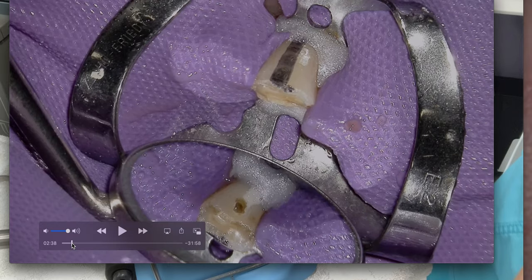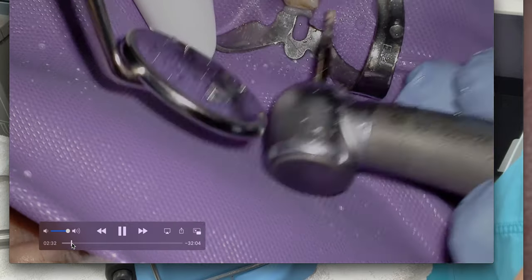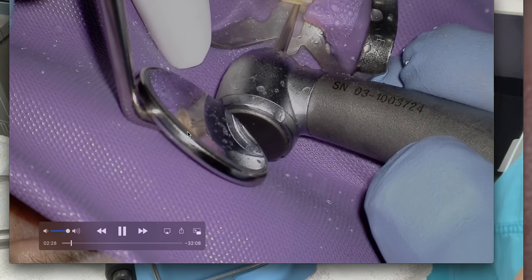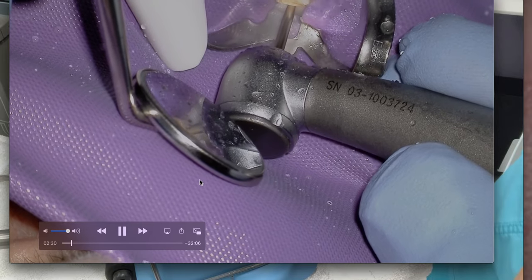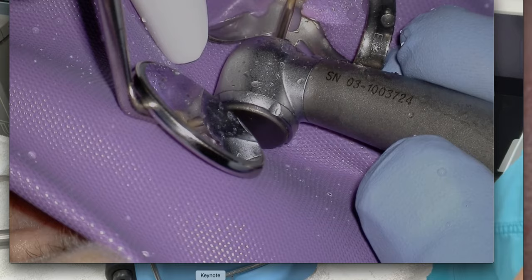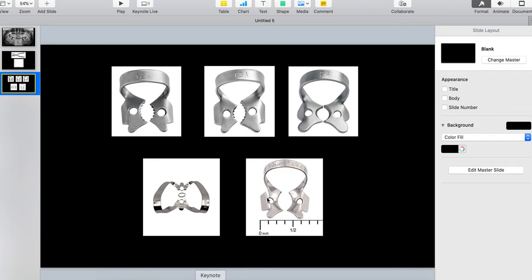You can see we're lining up our access. Let me know if you want to see this full root canal down the road. My focus today is just on rubber dam clamps. Using the winged version is really helpful for anteriors — the 212 without wings is really complicated to put on; it's just frustrating.